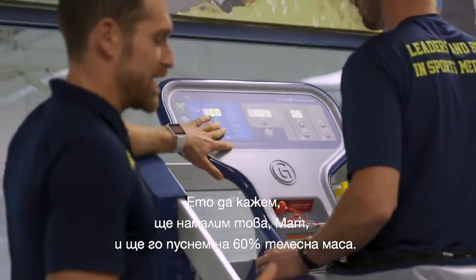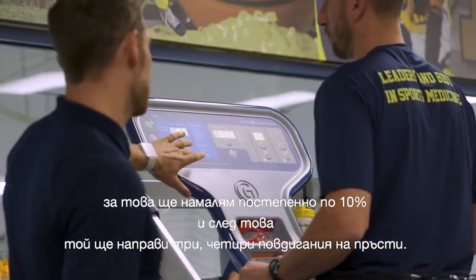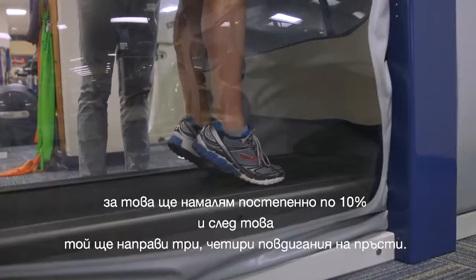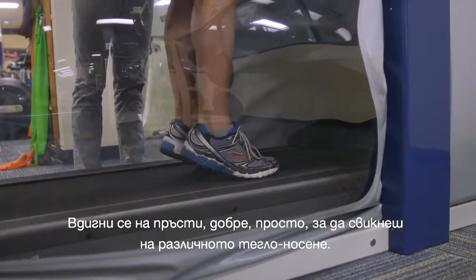Let's say we're going to take this down and run at about 60% body weight. I'll go down 10% at a time, and then I'll just have him do about three or four heel raises — come up onto your toes — just to get used to that different weight bearing.